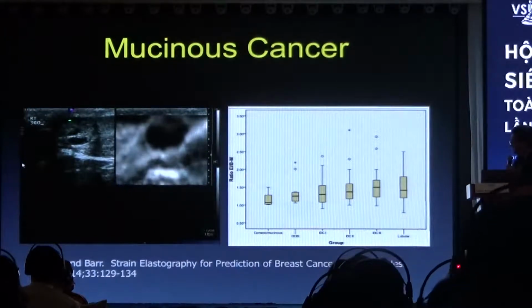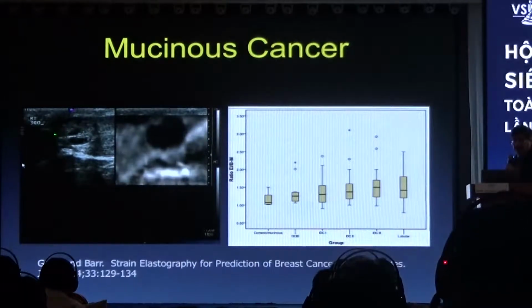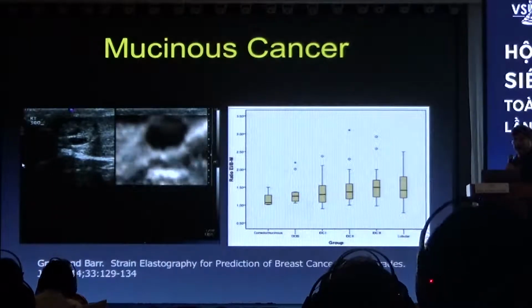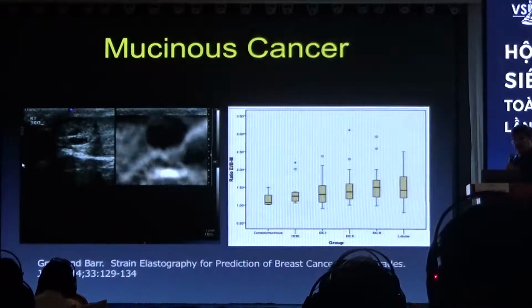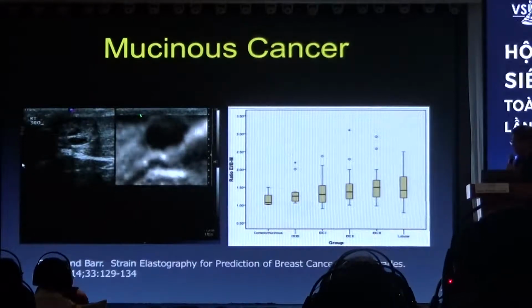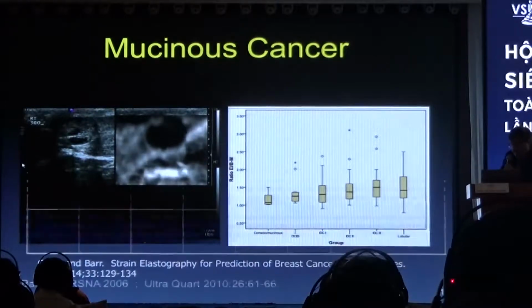If we have a lesion, like say fibroadenoma or fibrocystic change, we often see it very well when it's surrounded by glandular tissue because it's very hypoechoic and the glandular tissue is very hyperechoic. However, they have the same stiffness. So in that case, we may not see the lesion very well on elastography.